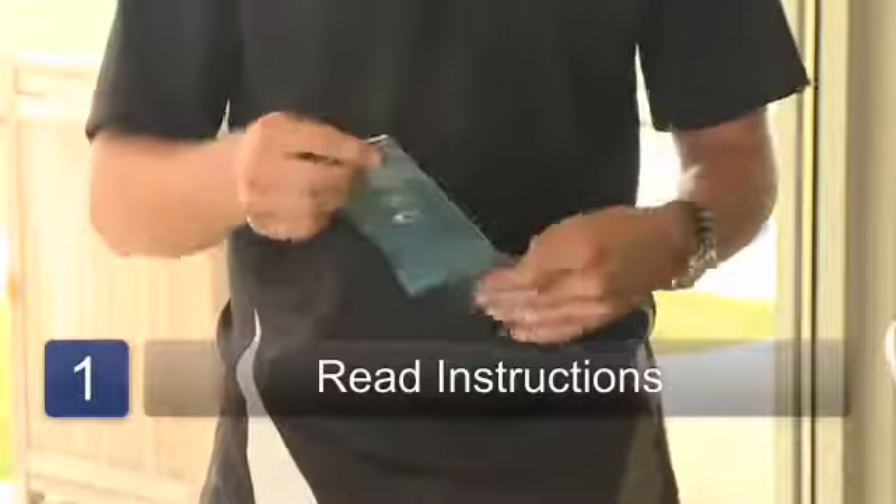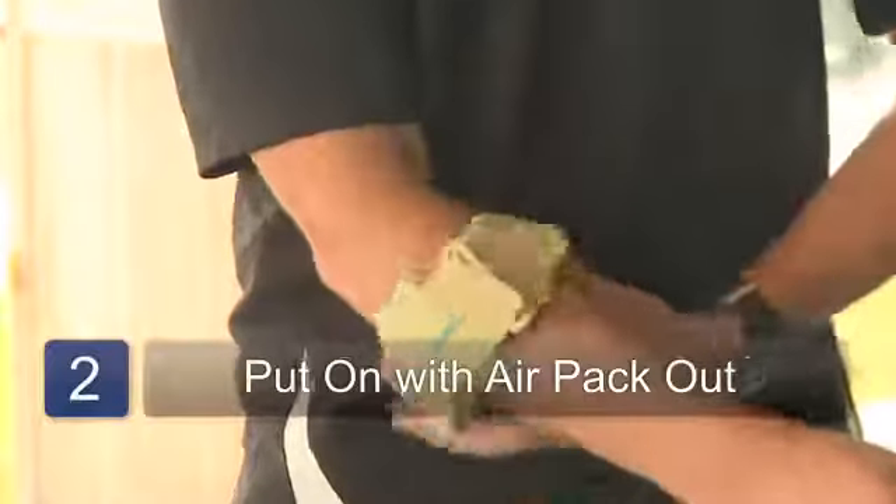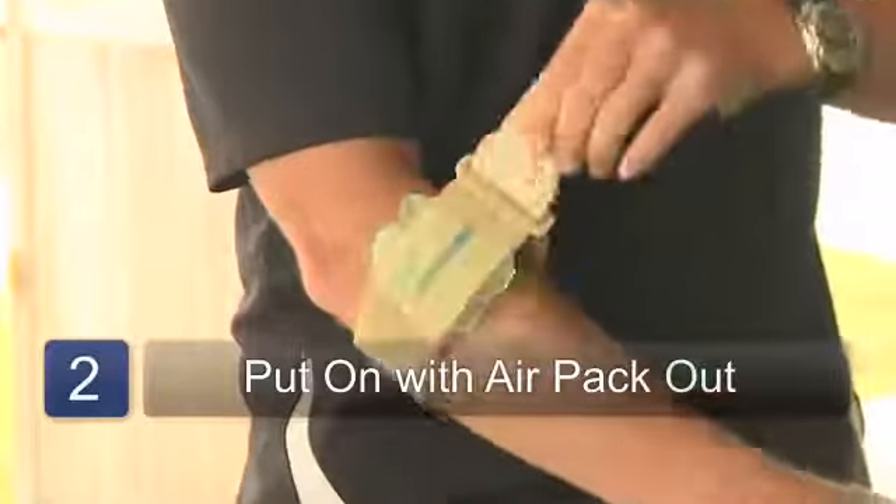Step one, you want to read the directions that come with the elbow brace. Step two, you want to put the elbow brace on with the air pack facing out on the top of your arm.